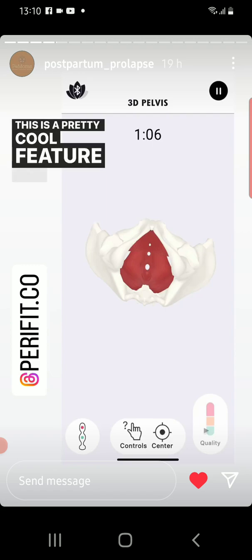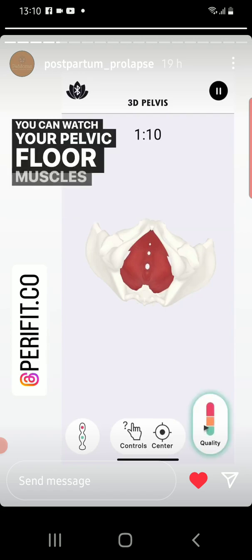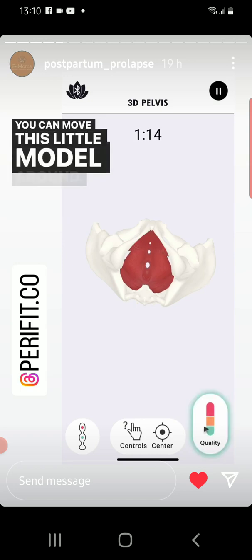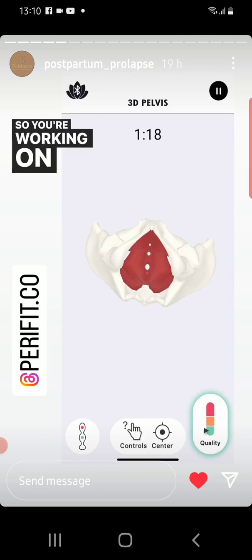This is a pretty cool feature for those of you who are really visual learners. You can watch your pelvic floor muscles contract from underneath, above, or the side — you can move this little model around. And then on the bottom right you can see your quality meter, so you're working on staying in the green.